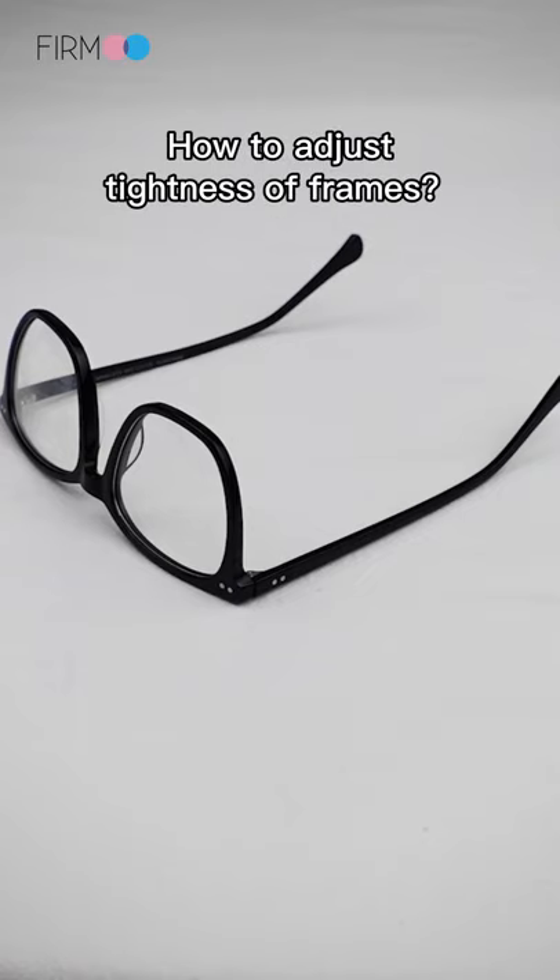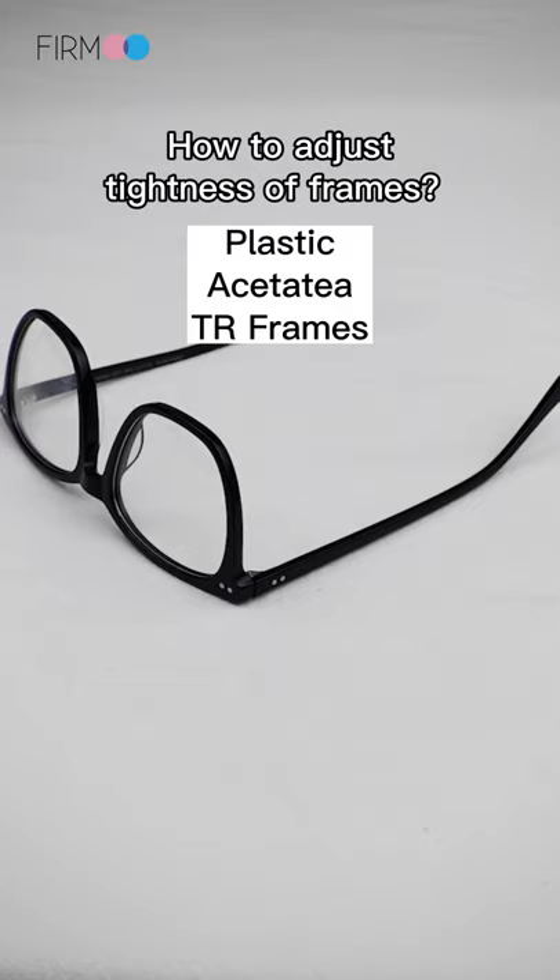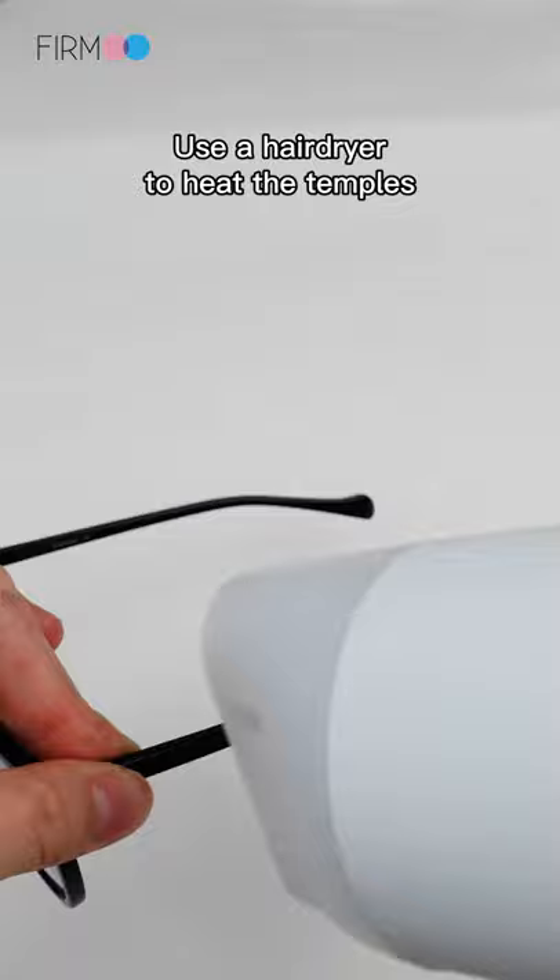How to adjust the tightness of plastic, acetate, and TR frames. Let's take a look at how to adjust the tightness of non-metallic glasses. Use a hair dryer to heat the temples for 20 to 30 seconds before adjusting.